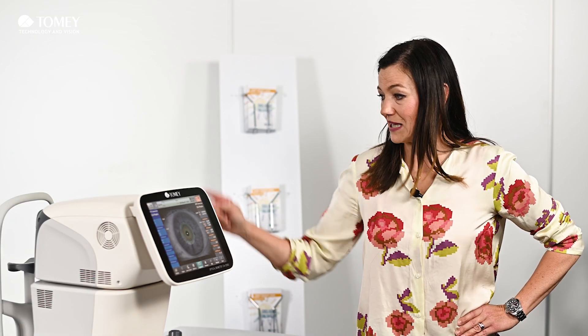We are using a topography Placido ring disc with in total nine rings, and we are taking a total 5.5mm diameter. This allows us to use ray tracing technology, which is basically the modern way of IOL calculation.